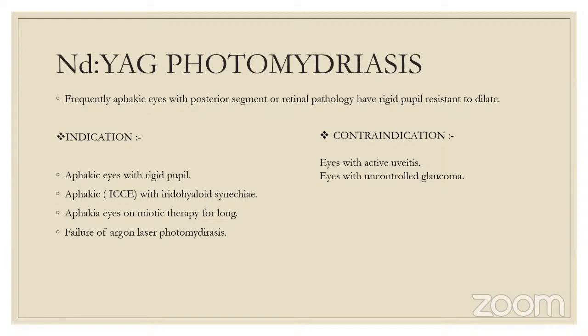Why do we see bleeding when we do iridotomy? It's photodisruption. Even when we are snipping off the iris with the scissors, we are crushing the blood vessels of the iris, so it is not allowed to bleed. With laser, we are actually hitting a spot on the wall of the vessel, so it's just opening up the vessel.